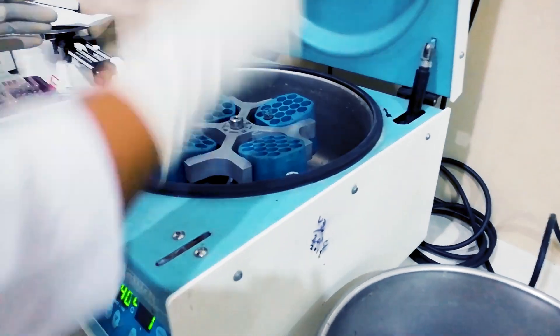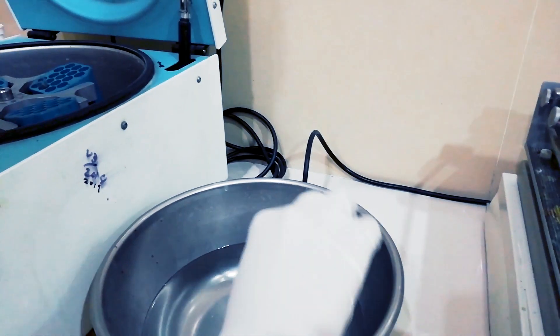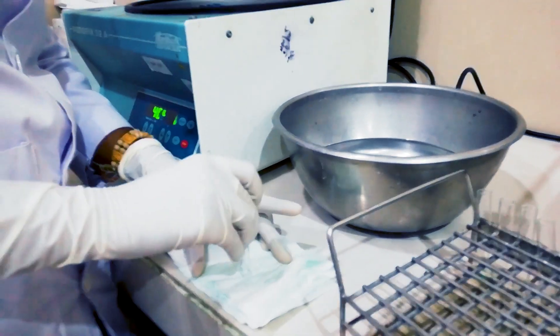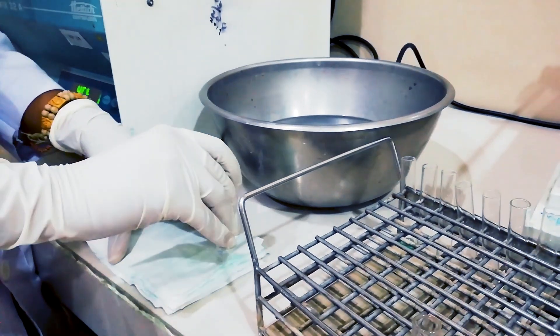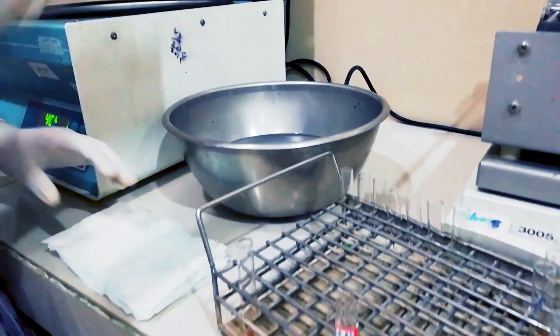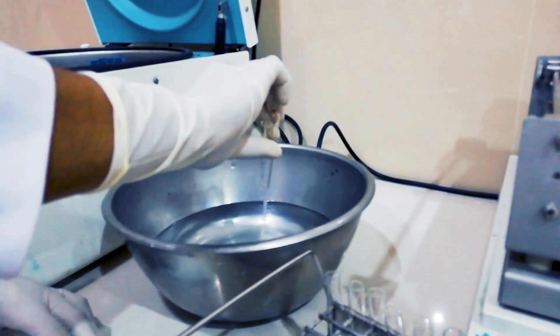This is our final and last saline wash. We will remove the supernatant. To remove excess water, we invert the tube once. We do this for each tube.